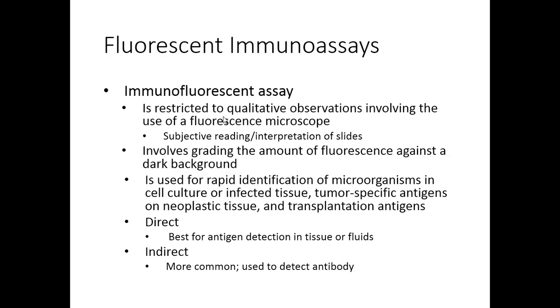The tests that we use are going to detect the fluorescent compound that results when a reagent is tagged with something fluorescent, and that binds to, for example, an antigen that was fixed to a cell, to a slide, and then we look at it under a fluorescent microscope.